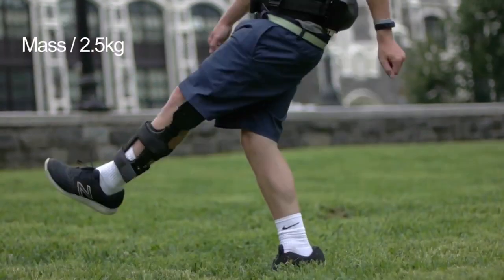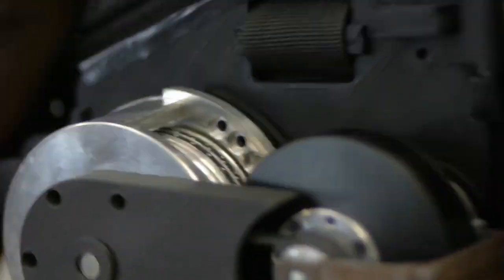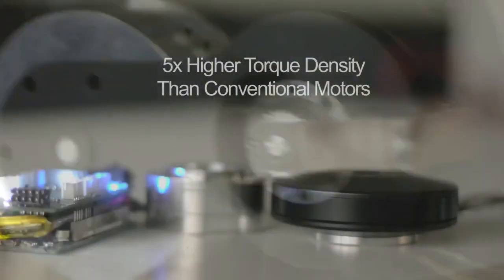This is the first exoskeleton that is ultra lightweight, with near zero resistance to human motion. Thanks to quasi-direct-drive actuation, it uses high torque motors with small ratio gears.